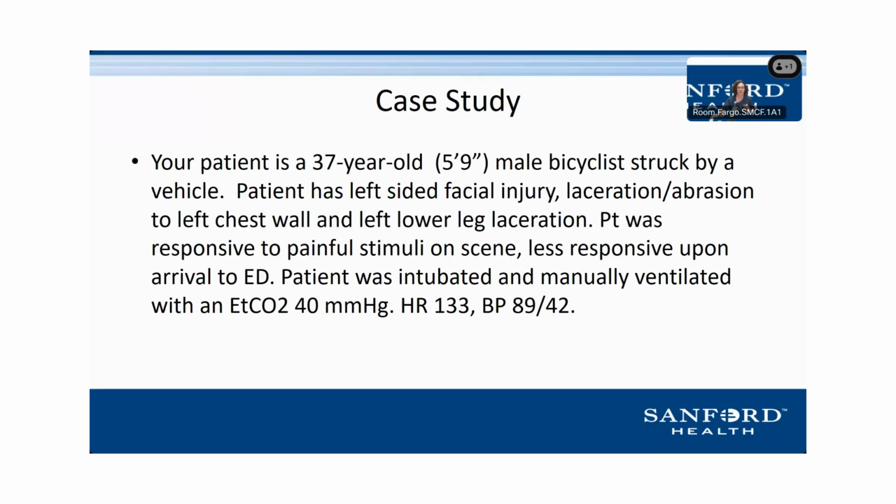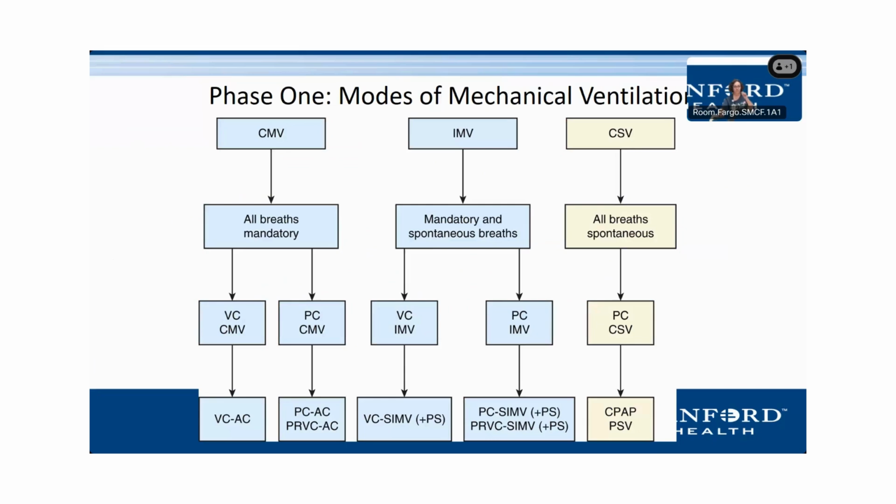Meanwhile, we're ready to put that patient on the ventilator. And so we have to pick modes of ventilation. And across the bottom are all the different generic names for the modes of ventilation. So these modes might not match up with what your ventilator calls them.